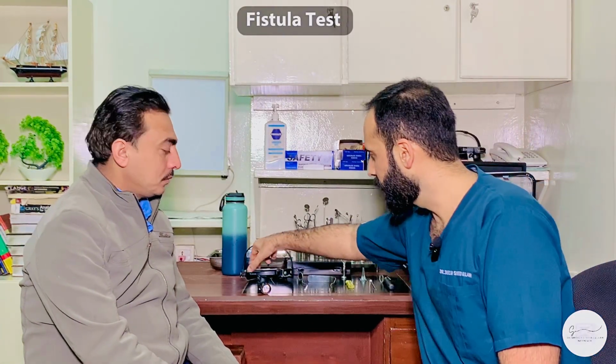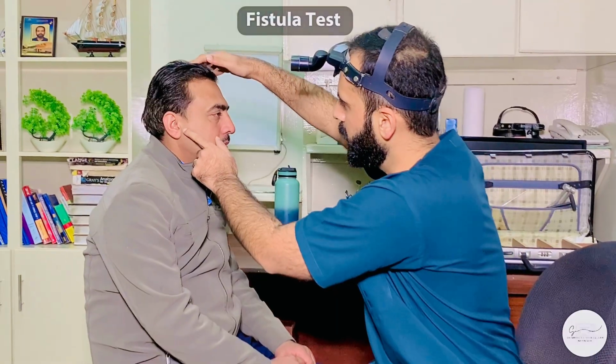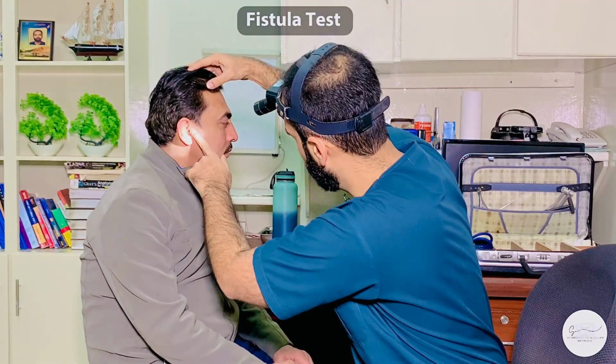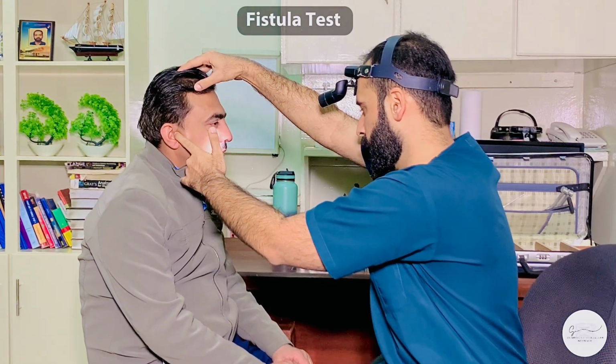After checking for nystagmus, the next test is the fistula test. How do you do the fistula test? Again, you take up the light source, you are one arm length away, you stabilize the head, you are looking at the eyes of the patient, and you gently push the tragus in, and you are looking at the eyes of the patient. If this maneuver is able to elicit a nystagmus, this means that the fistula test is positive.